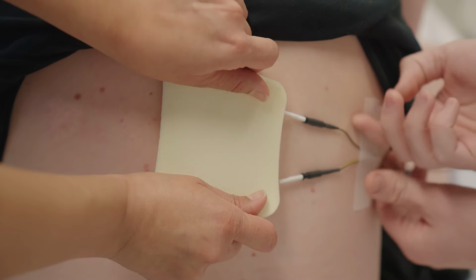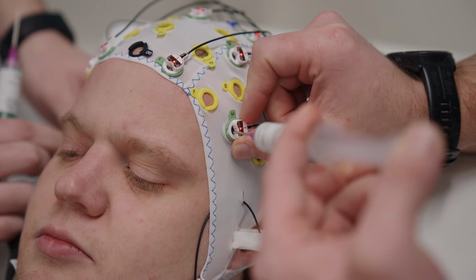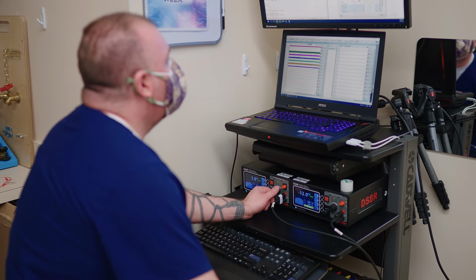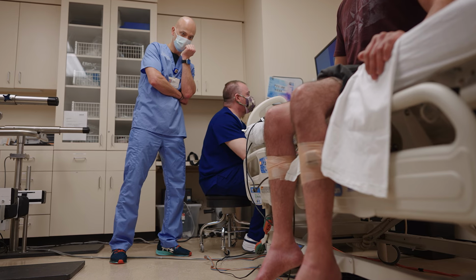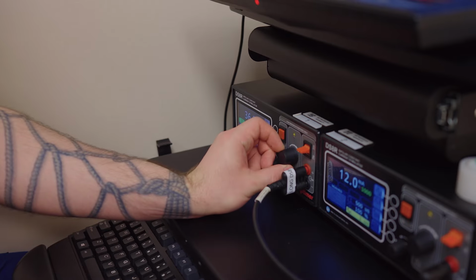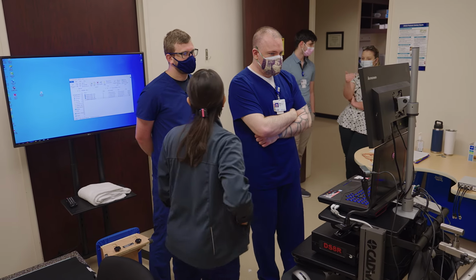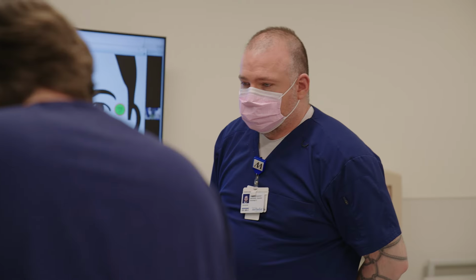We've developed some equipment that allows us to plug into the electrodes directly, custom equipment that only exists here at Houston Methodist that will allow us to model how the spinal cord responds to stimulation. So there is nearly an infinite search space for the stimulation parameters that we can adjust, from amplitude, frequency, stimulation waveform, and all sorts of other parameters. So the equipment that we've developed will help us narrow that search space down to better target what we need for the person that we're helping restore function.